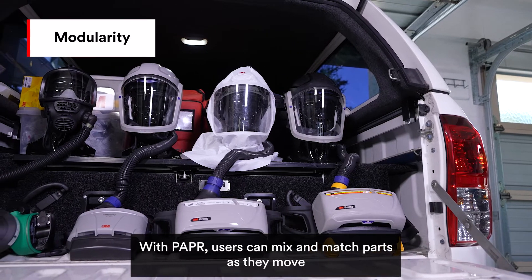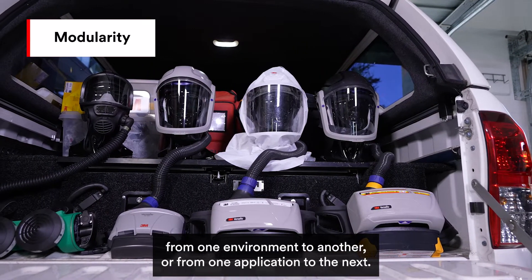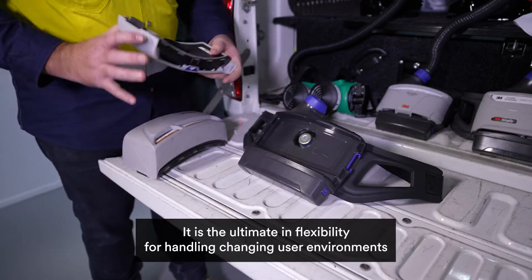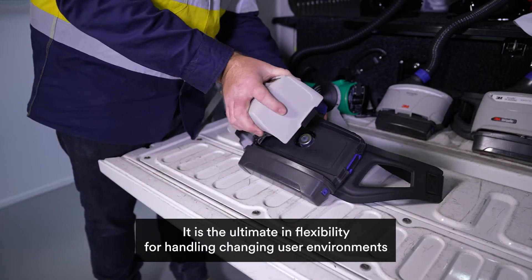With PAPR, users can mix and match parts as they move from one environment to another or from one application to the next. It is the ultimate in flexibility for handling changing user environments.